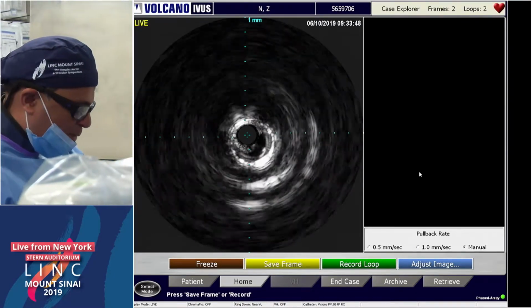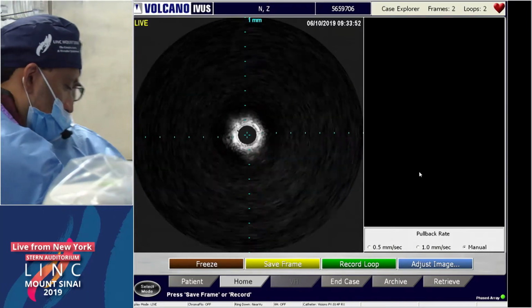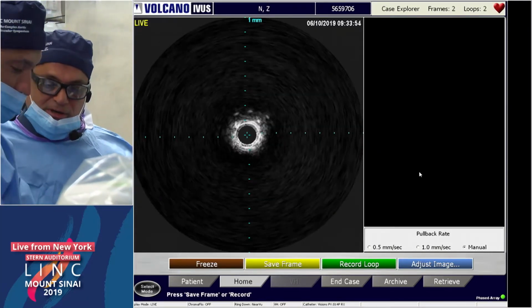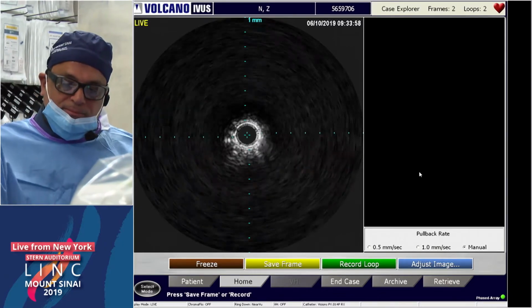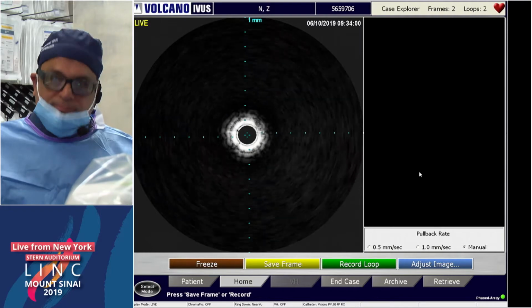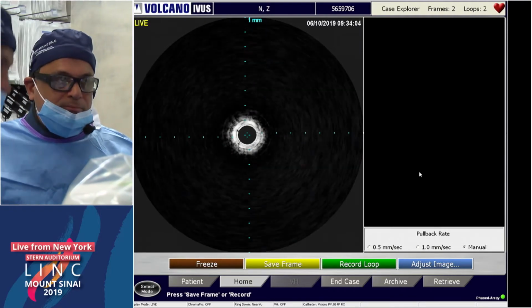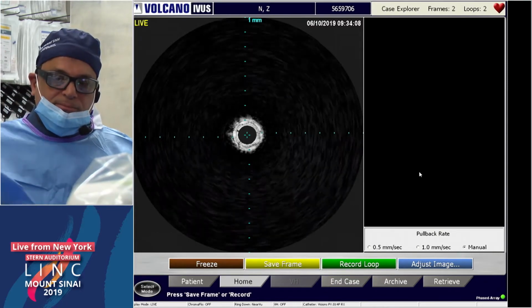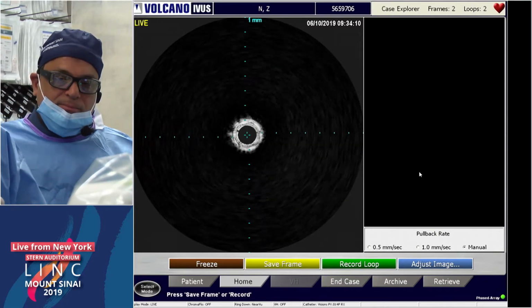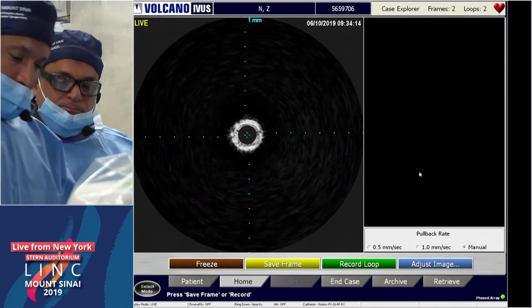It really works well. I don't know what the panel does in terms of atherectomy. I know Brian has tremendous experience with directional. I would love to hear his comments. Yeah, I do like directional for these cases with the new HawkOnes. They actually do a very good job in the common femoral. That said, if you're protecting your profunda, you often don't have room for the nose cone proximal to your filter. And the issues you described with the iliacs are certainly true. You've got to pull that sheath back to expose the jog. So there are some challenges to using directional as proximal.